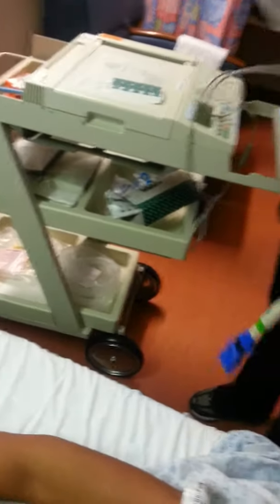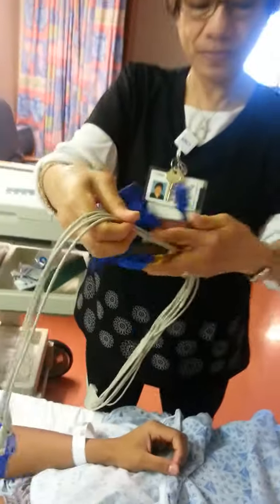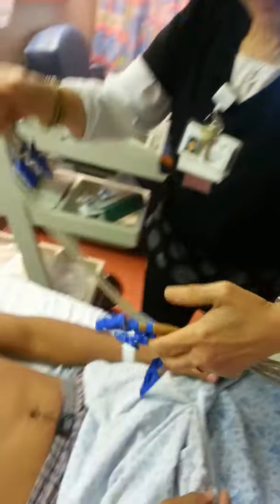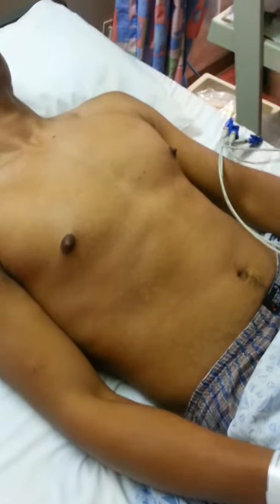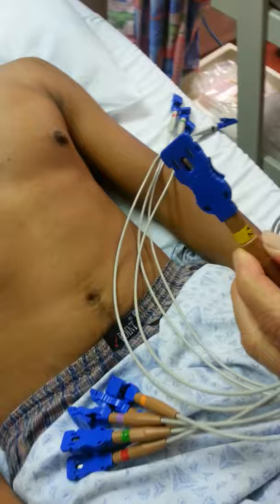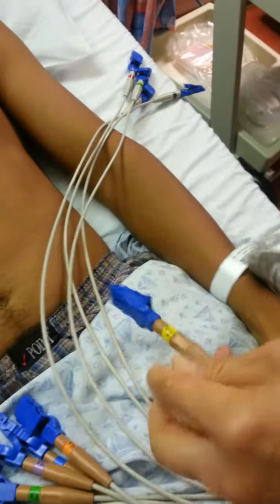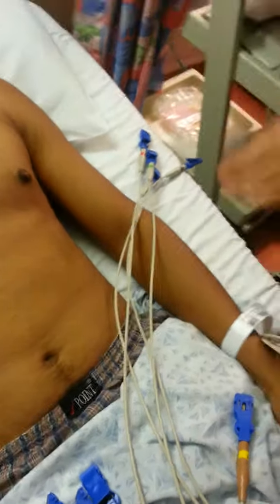This is the 12-lead EKG machine. With a 12-lead EKG, it's easy because it tells you where to put everything — it has V1, V2, up to V6, and then there's the right arm, left arm leads labeled on the machine.